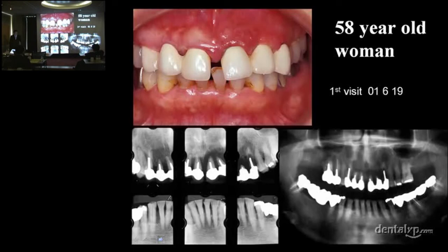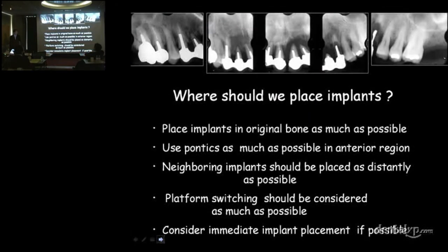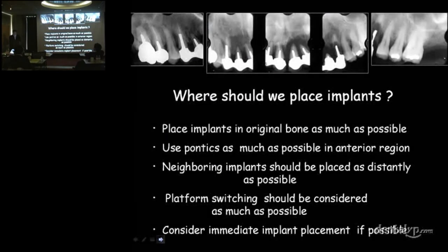In complex cases, the selection of abutment teeth is essentially equal to the timing of procedures. We have established some rules to make this selection easier. I will now discuss this selection process. These are periapical X-rays.